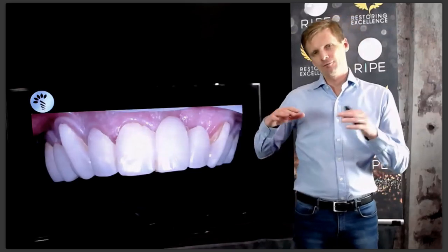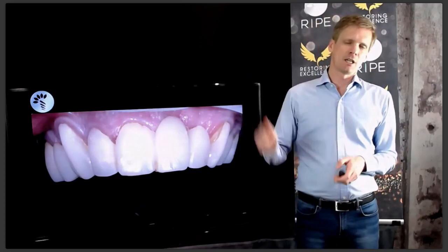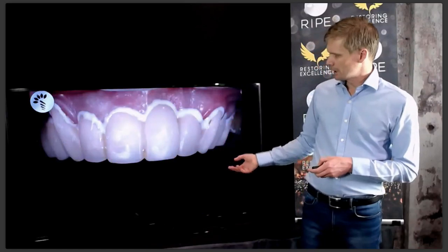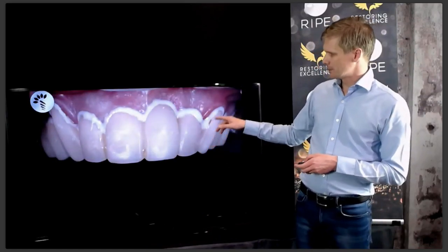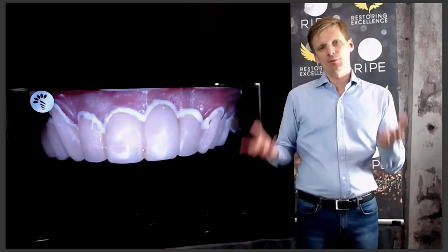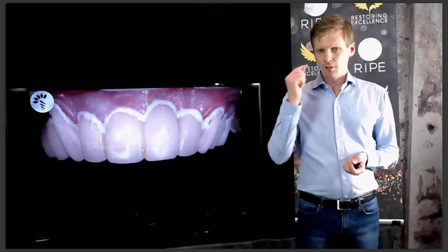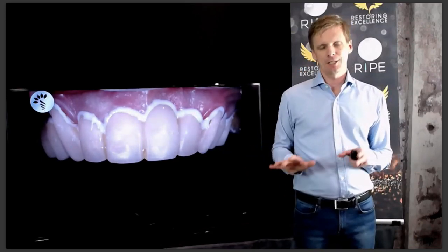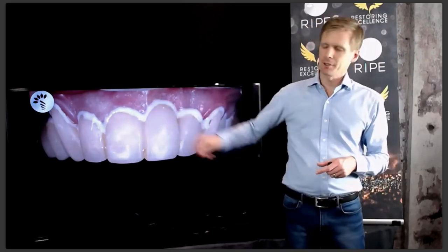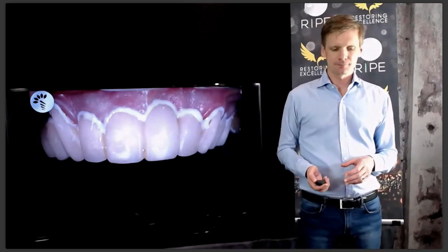So now we've finalised the lower teeth, put the patient in temporaries, made sure they look good, finalised the lower teeth. Now we're finalising the upper teeth. So we're right here, what we're doing is relining around the gingiva with some flowable prior to taking impression for the mock-up. So when you make temporaries, you'll notice that quite often they get too thin around the gingival margin. So instead of trying to fix it afterwards, sometimes you can just put some flowable around the teeth, take an impression, and use that impression for your temporaries.